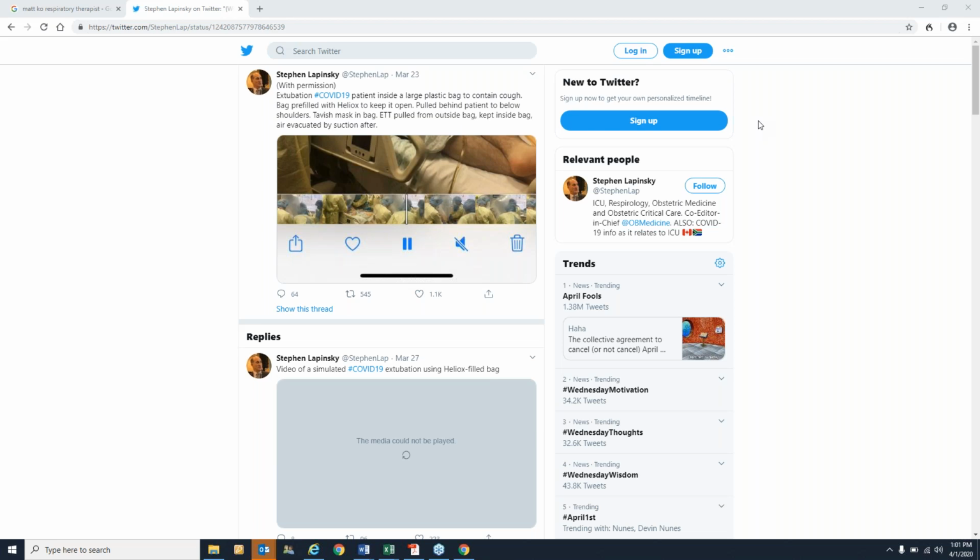Okay, we're scrolling down. Okay, Scarborough Health Network's experience with Servo U and Servo I ventilators is that they don't have heated expiratory blocks, so there is often condensation in the circuits requiring a break of the heated circuit or a change of the HME. These circuit breaks are considered aerosol generating medical procedures. Absolutely they are. And you must.